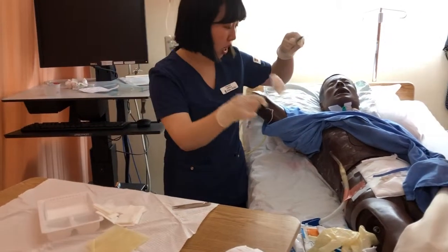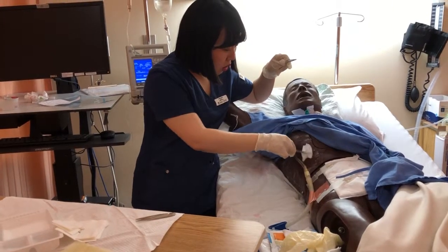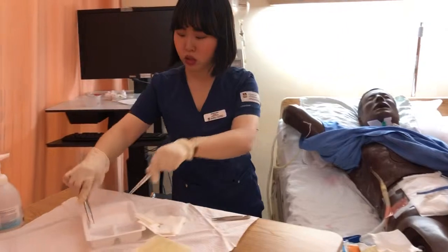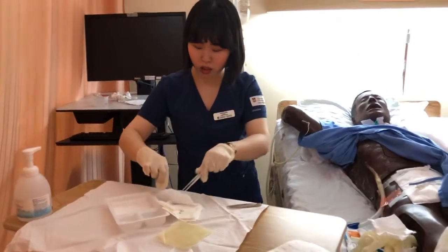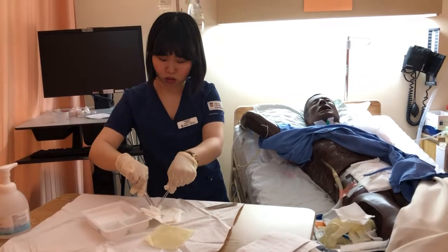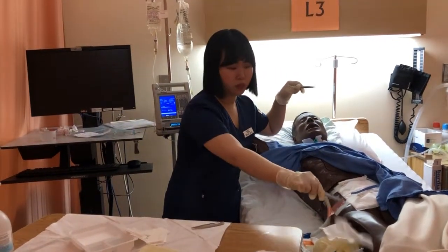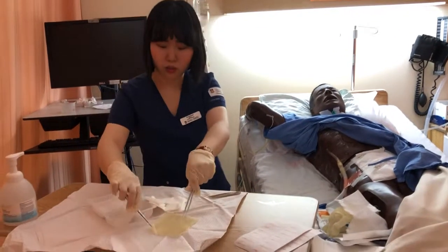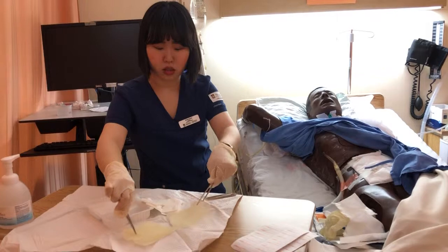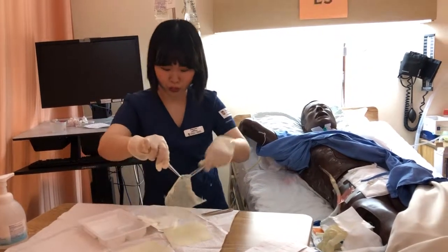So this is for drying. As long as you go from inner to the outer, you're still keeping the sterility here. And dry the tubing. Yeah, it's not as bad as you think it is. I'm gonna put the diluent here. So I'm still aware of my 2-inch border here.